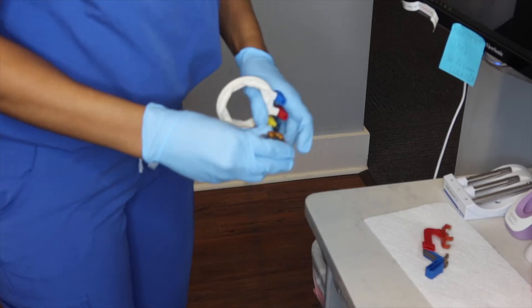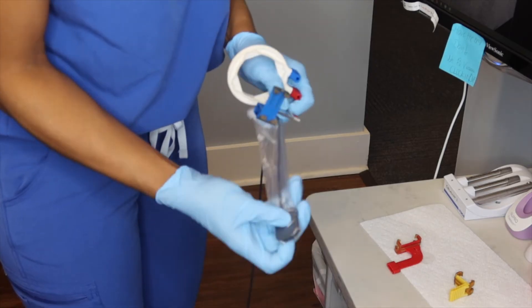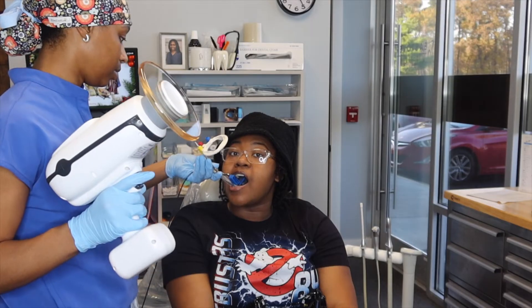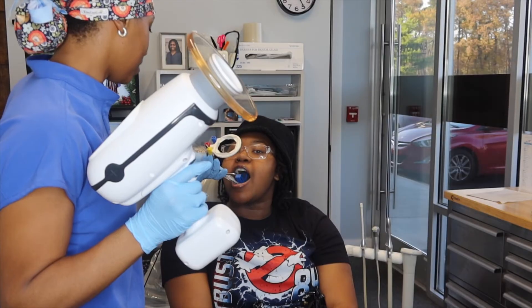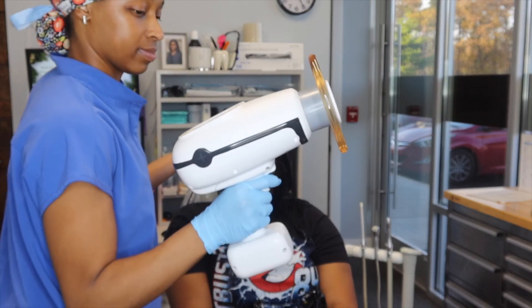Now we move on to the anteriors, starting with maxillary. It's time to change your bite tab — instead of the yellow used for posterior, now we use the blue for anterior. Fun fact: if you use the circle ring that has red, yellow, and blue on it, you don't have to change it from posterior to anterior — it stays the same, you only swap the blue tab. Starting at the maxillary right canine, there are three images taking you all the way to the left canine. I don't walk around the patient; I either ask them to turn to me or I lean slightly over them.